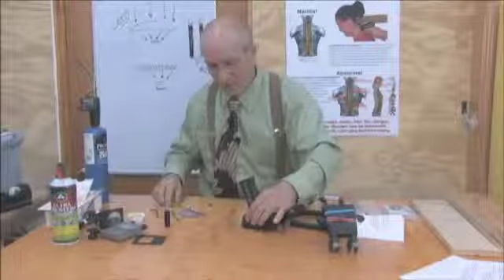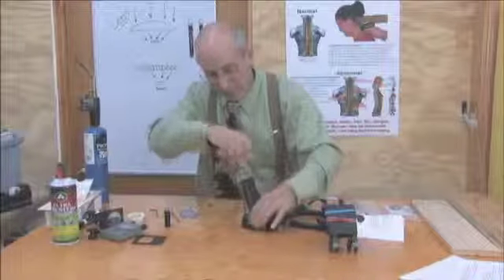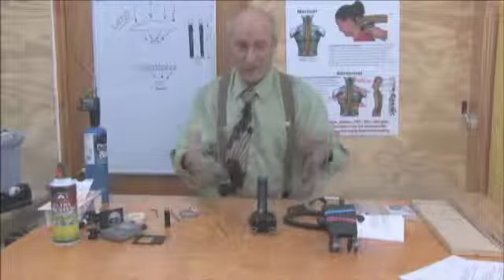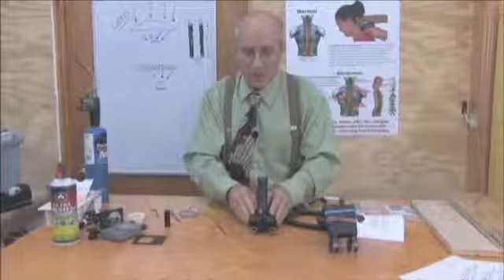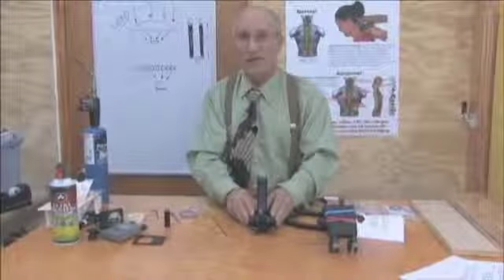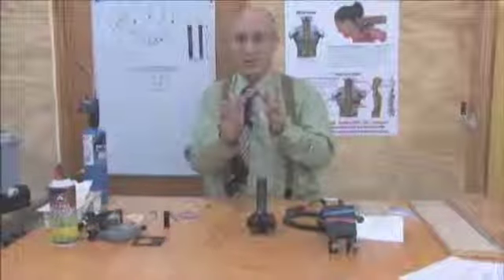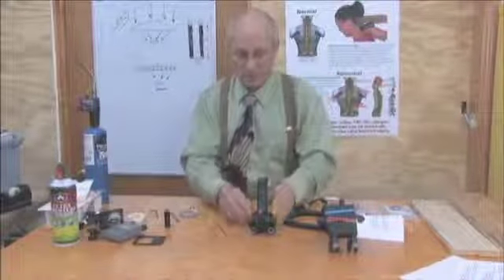And we would go ahead and tighten the screws in. Don't over tighten them, just snug, and your scanner is repaired. Having dropped the scanner should not affect the calibration in any way. If you start to do graphs and the center of your line graph remains centered as it was previously, everything is fine, no worries.